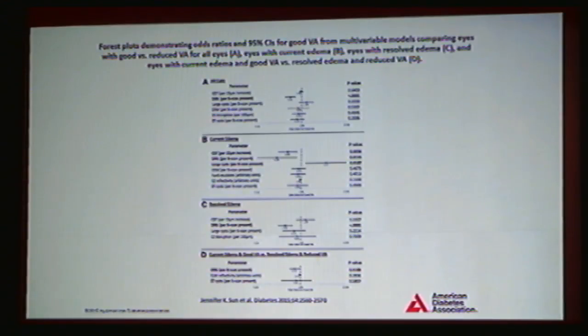So if we look at the quality of the OCT, whether there are photoreceptors or not, whether there's DRIL or there's no DRIL, we may better guesstimate what will be the outcome of that patient rather than just looking at thickness, which seems to be a very, very poor predictor for good vision. So once we have identified the OCT, look at the patient, explain things to the patient, we need to make our decision, what is the treatment that we are going to have with this patient.